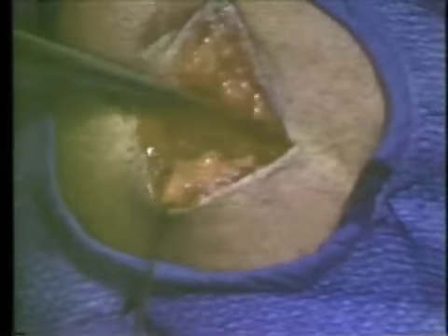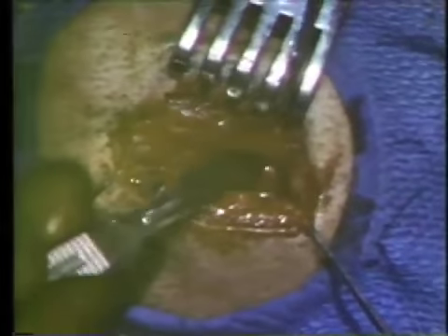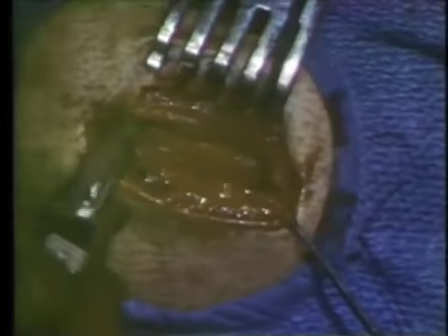The reason that it is not firmly secured, of course, is that the true target position of that anterior segment has not been reached, and it will be determined not by the bone contact margins that are fairly arbitrary, but truly by the functional occlusion. So again, repeating the same approach on this side, which we'll try to abbreviate a little.